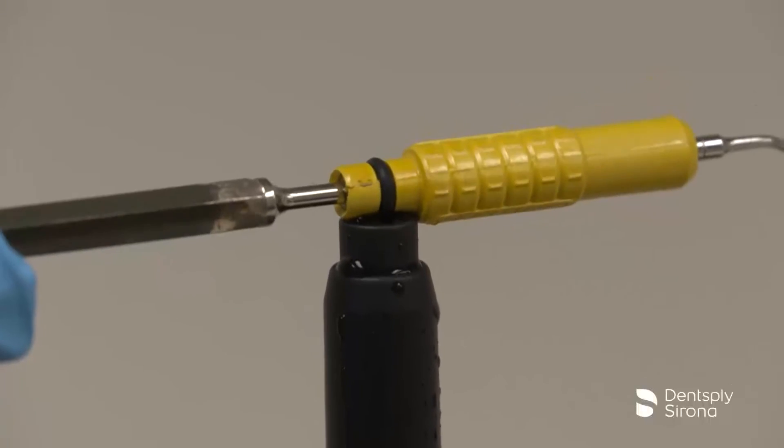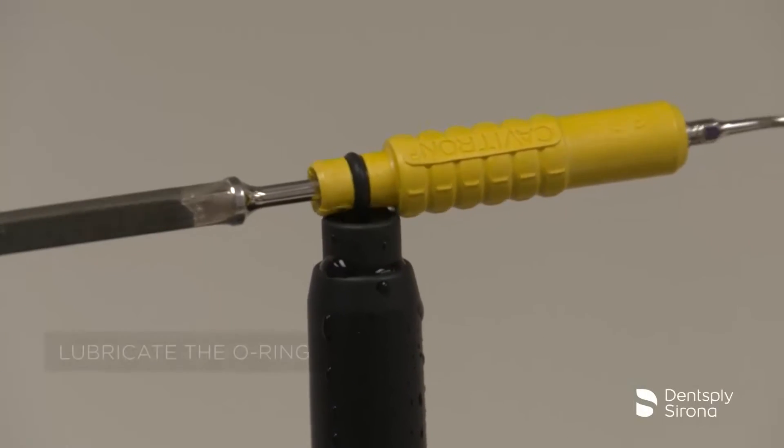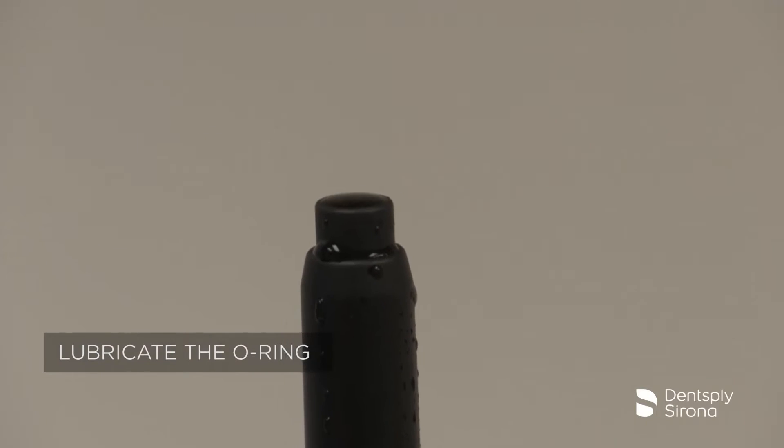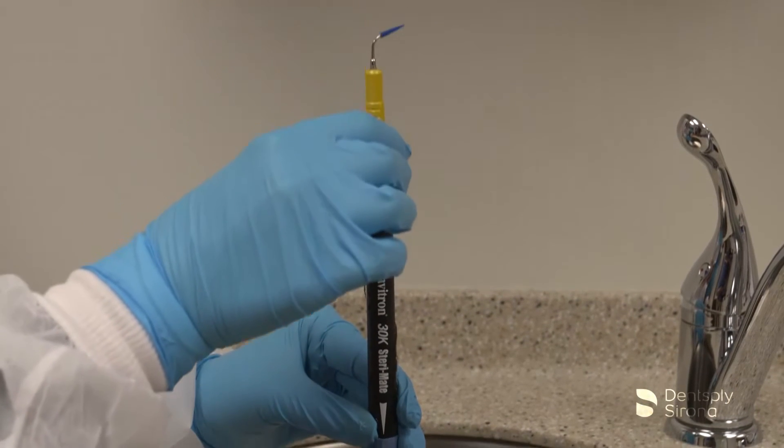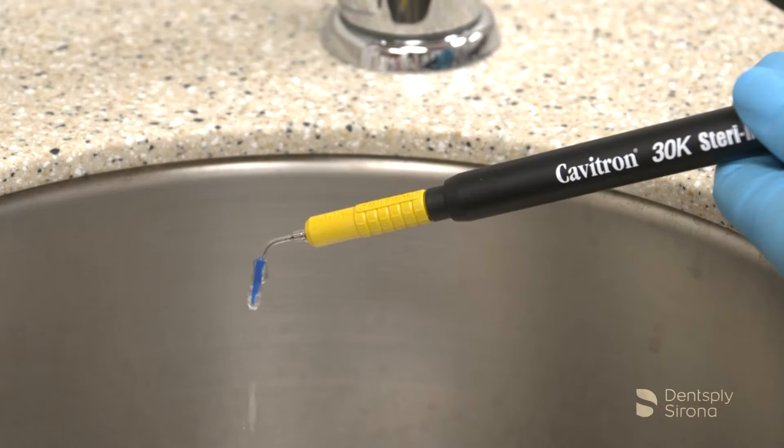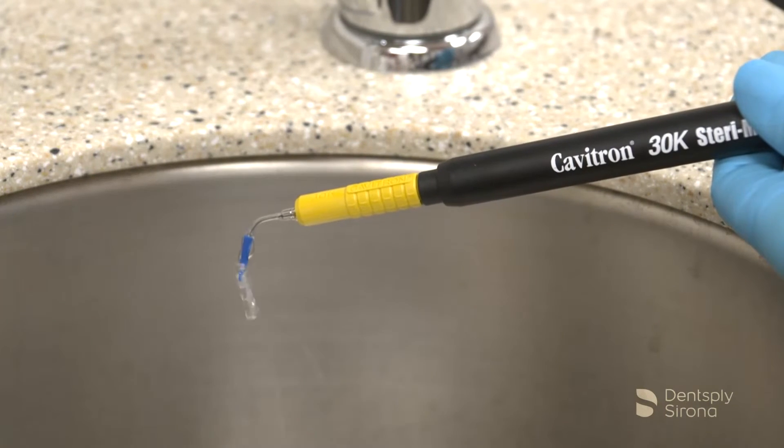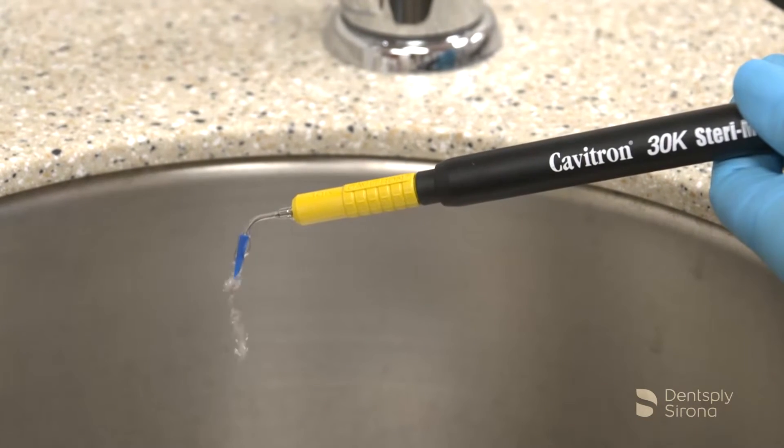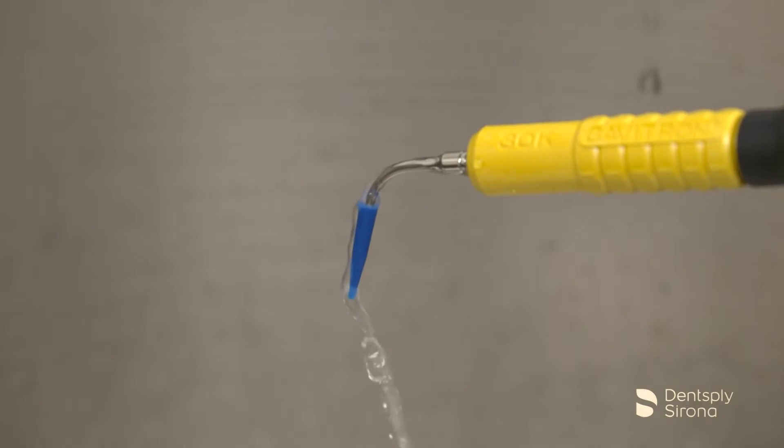After the clinician has placed the Soft-Tip Disposable Profi-Tip with the wrench included, filled the handpiece with water, seated the insert, selected the power, and adjusted the water flow to obtain a fine spray, instrumentation begins according to the treatment plan prescribed for the patient.